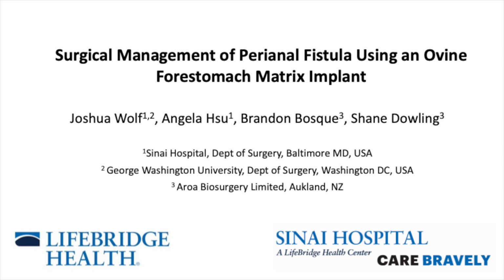In this video, we present surgical management of perianal fistula using an ovine forestomach matrix implant.